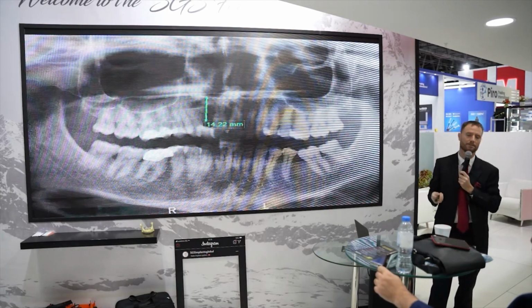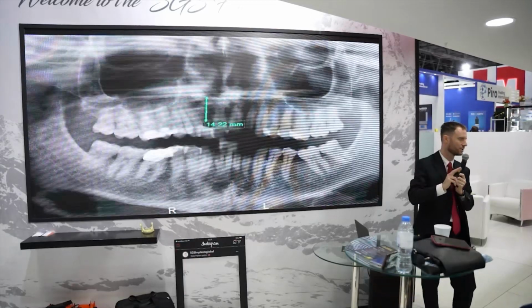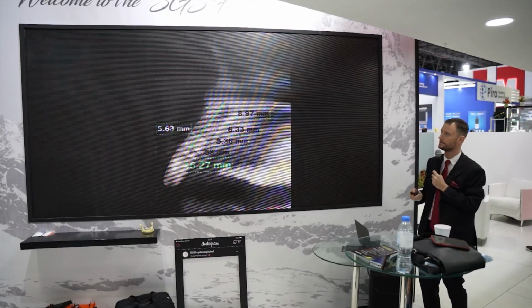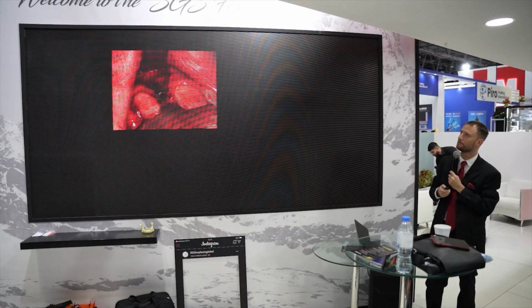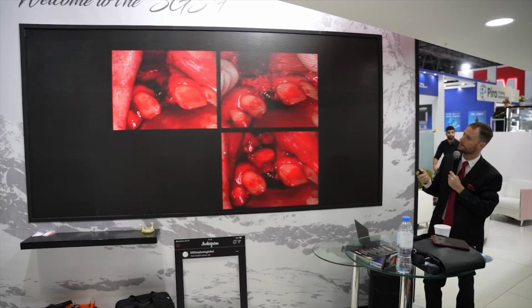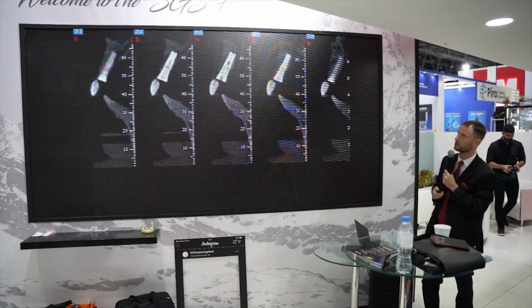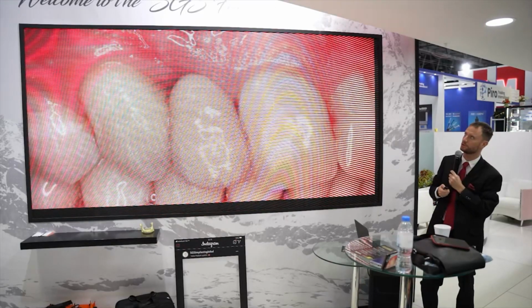Then we had the next step, the spiral tomograph, when you had a sort of 3-dimensional era where you could do a cross-section, but again, a very old case just to show you what was in the past. We could plan the implant. We needed the same calibration way. That's a very old case. I wouldn't do a bone grafting like this today, not even the flap. But what happens, you know the situation, you know where you want to put the implant, and you can build up the whole situation according to this. This is the post-op CT with the buccal bone and the soft tissue healing.